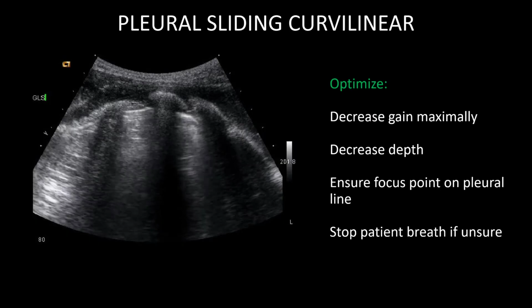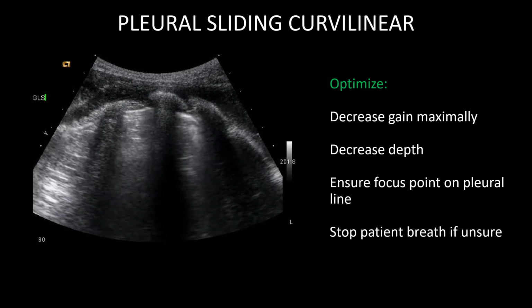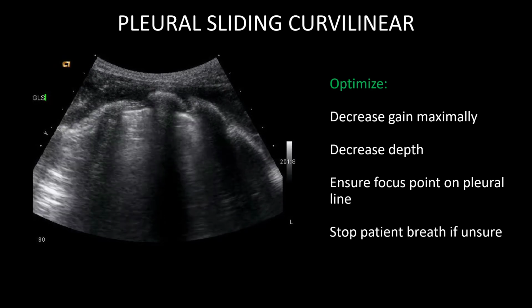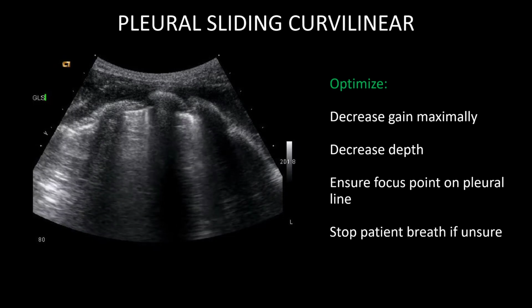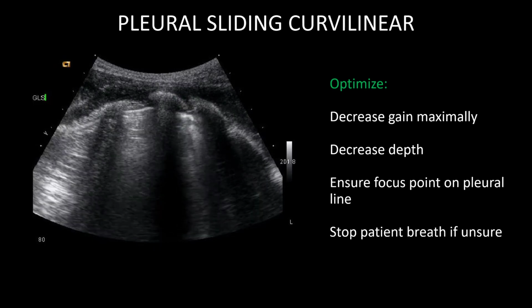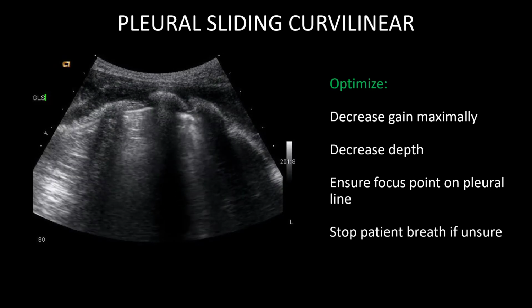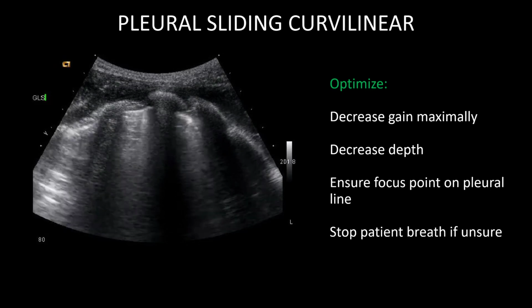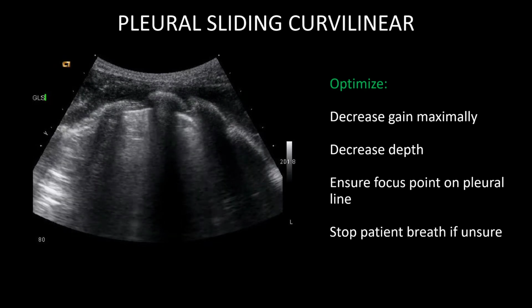Pleural lining assessment is one of the earlier things that is taught to ultrasound learners because it relates to pneumothoraces. Pleural sliding is a shimmering of the pleura that is timed with each patient's breath. It is sometimes compared to ants walking back and forth. When assessing for pleural sliding, the probe has to be positioned anteriorly on the chest in the area of least amount of dependence. Usually, one will use the curvilinear or phase array probe initially as it is versatile for other parts of the whole body ultrasound.